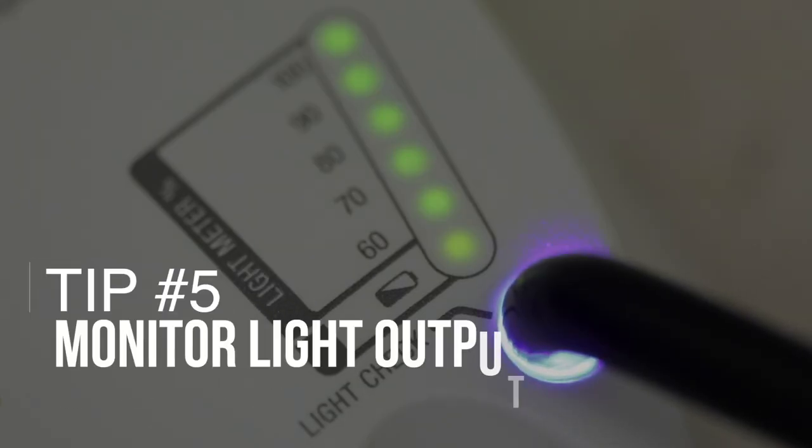If you know certain parts of your preparation are receiving less energy, that's also an indication to use longer curing times — delivering a lower amount of energy over a longer period of time, which more likely leads to increased depth of cure. Tip number five: frequently monitor your light output. Lights tend to degrade over time, losing the amount of energy they put out.